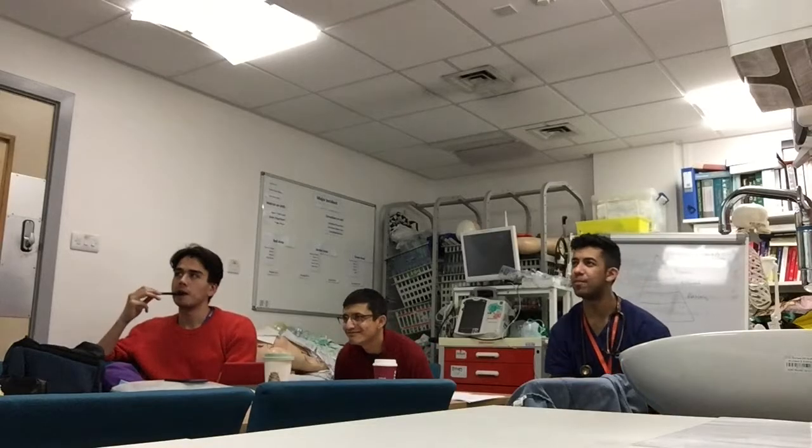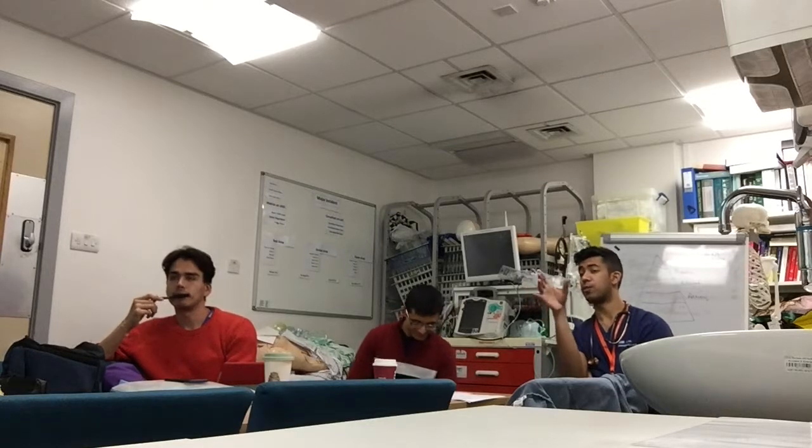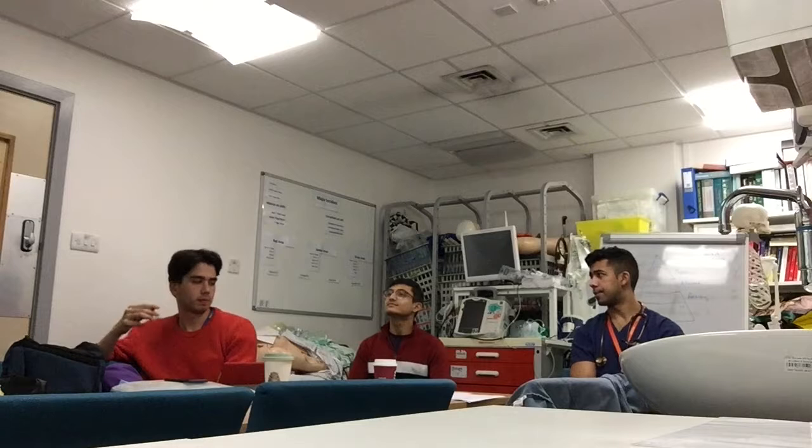Okay, so I put this in because this is a very common trope in blood gas. This is like one of those memes, really, about the chronic COPD patients: they don't need to have oxygen, they're on 88 to 92%. Do you guys know about that? There are some patients who you've got to be careful with when it comes to oxygen titration, and those are the chronic COPD patients. What is that blood gas telling us?